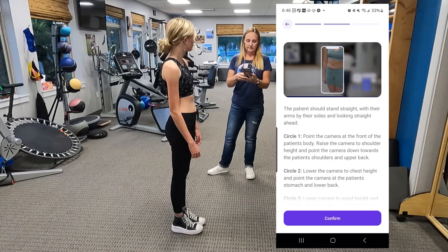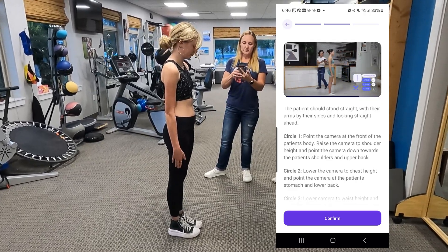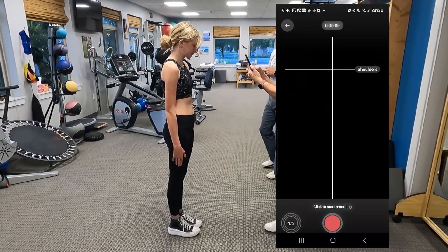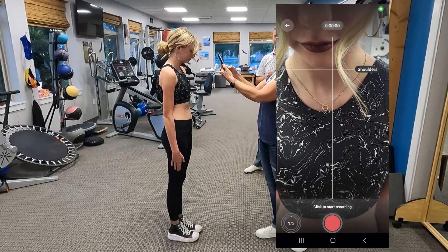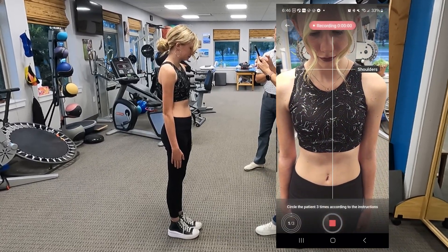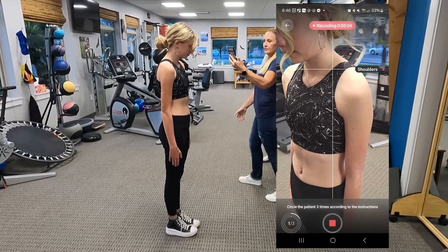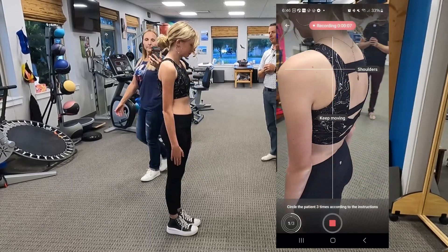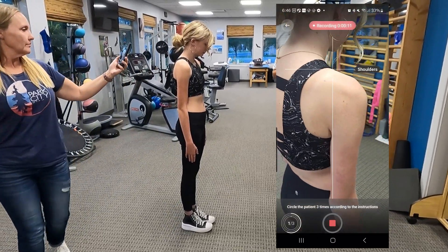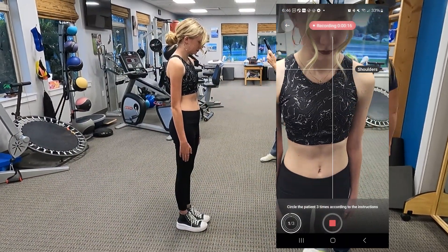Dion will hit confirm that she knows what she's doing, and Addie's ready. It will walk you through if you're going too fast, if you need to go slower, or if you need to be further away. We complete the first circle at the shoulder level.